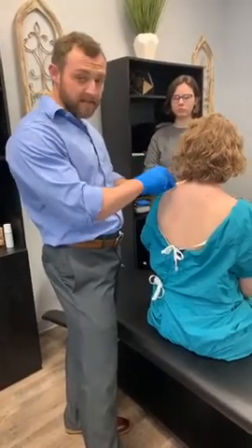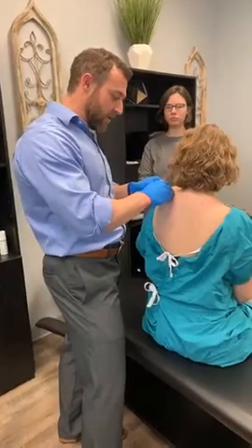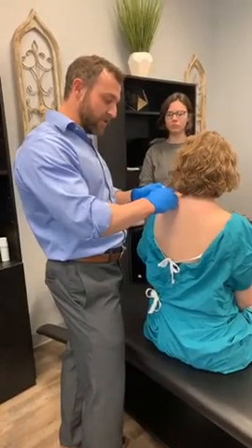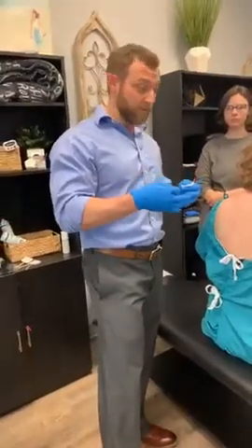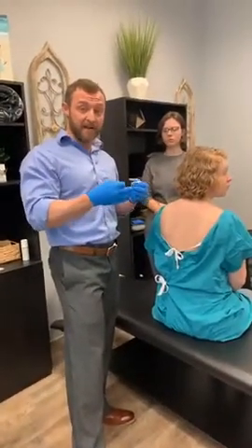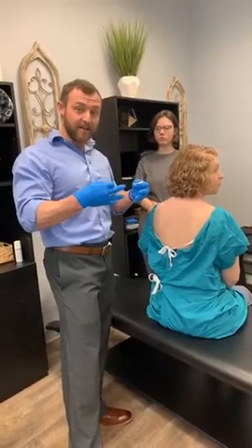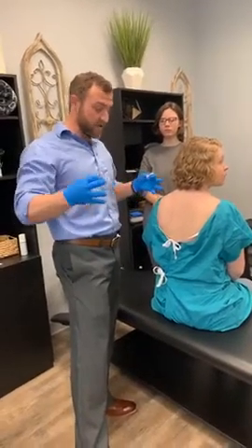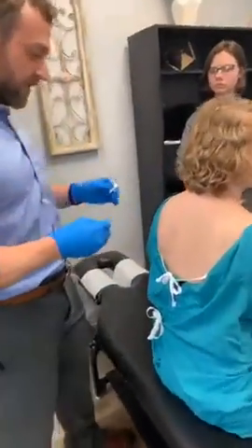When we hit these knots with the needles, it has a tendency to have a neurologic chemical effect on something called acetylcholine. That's what creates these knots, when acetylcholine is too active in an area of a muscle fiber. The needle can break that activity up at those end plates, and then the knot goes away. It just dissipates. So the symptoms resolve pretty quickly.